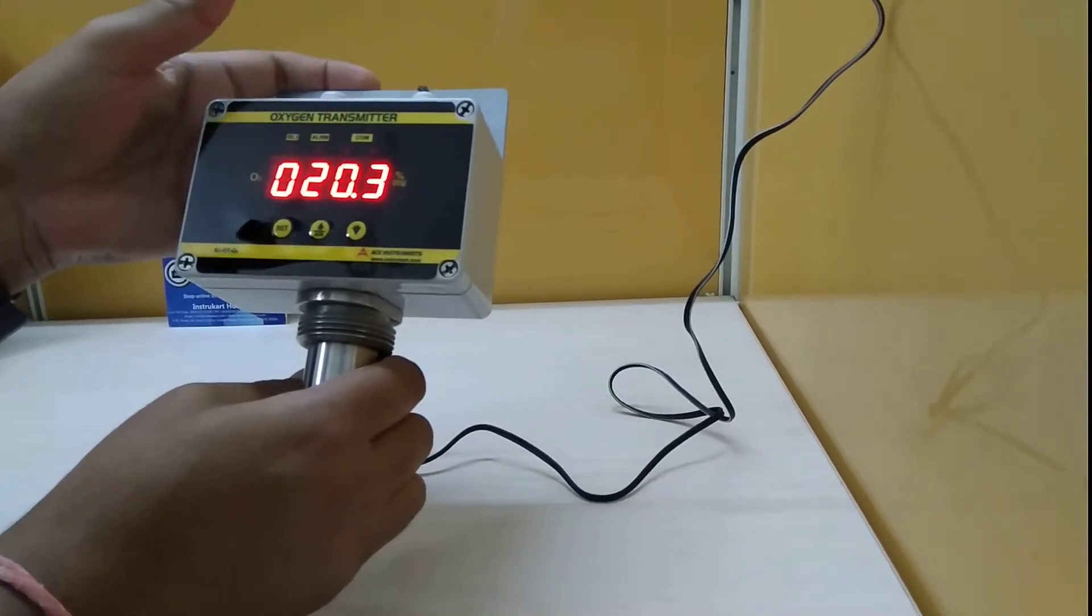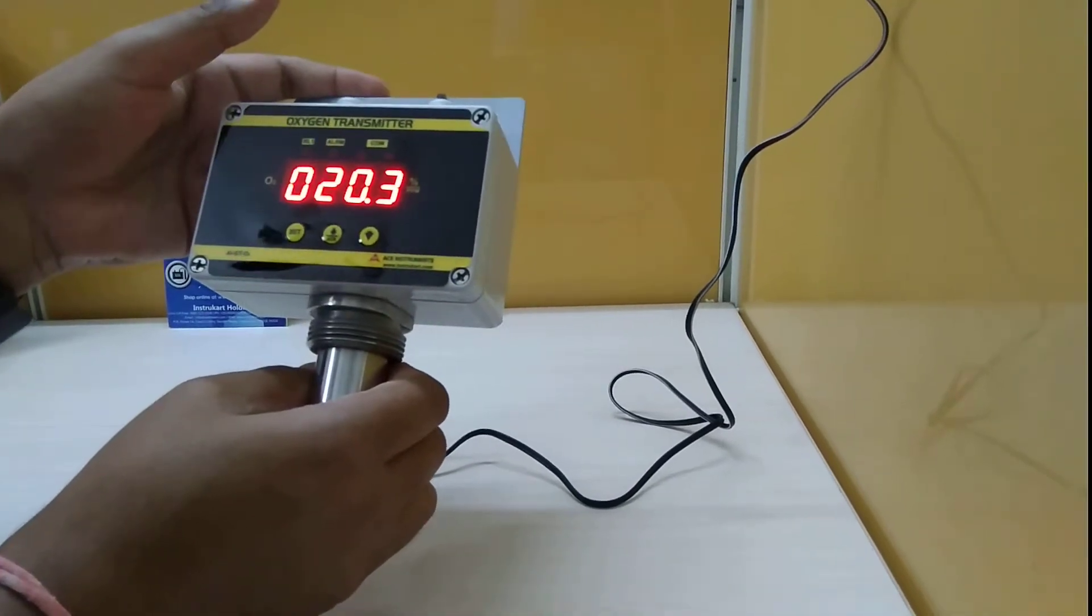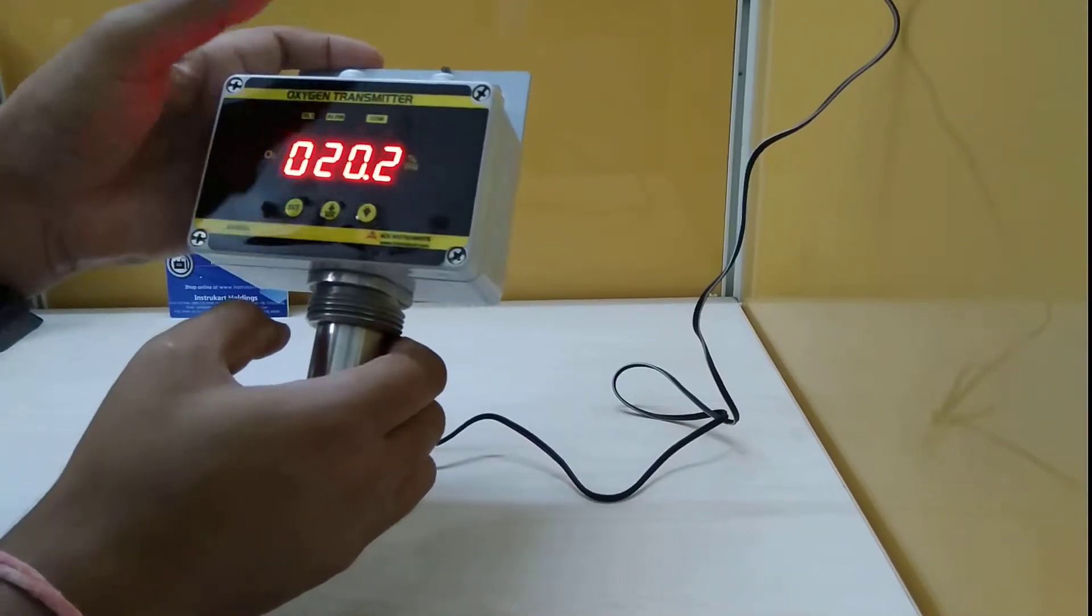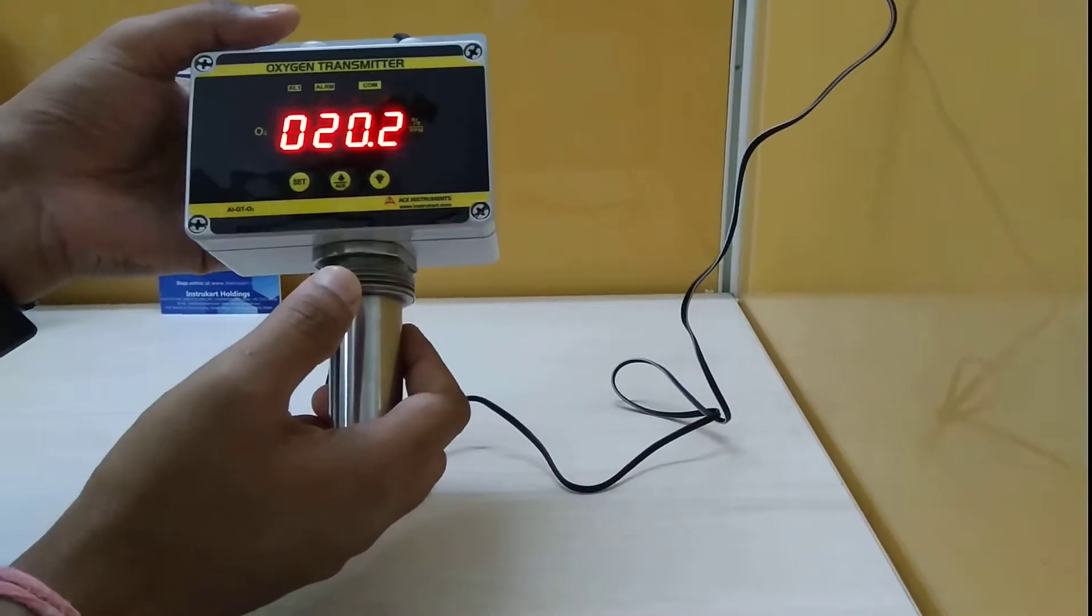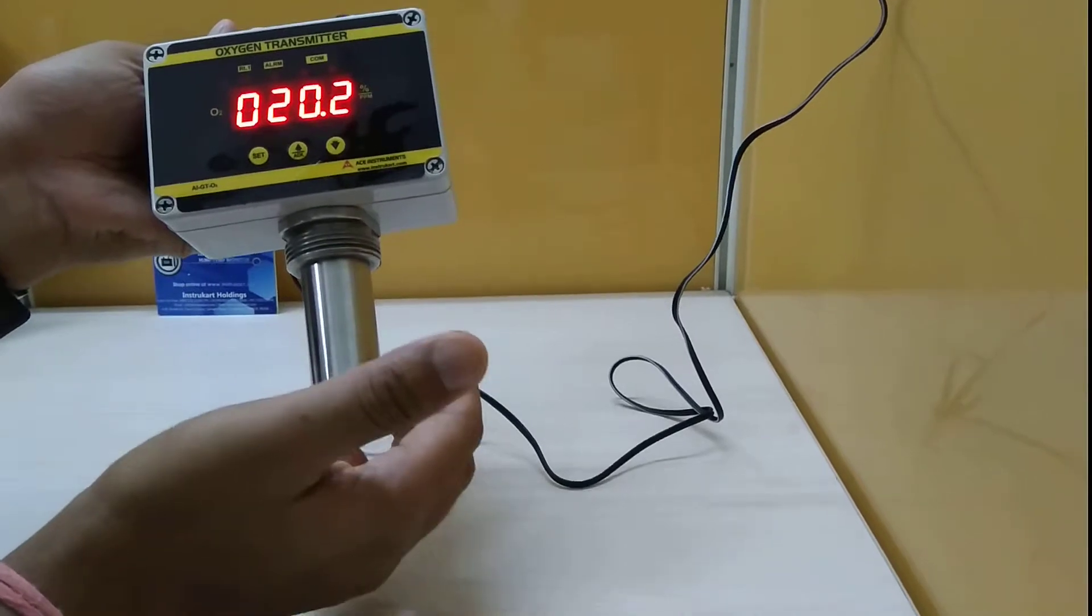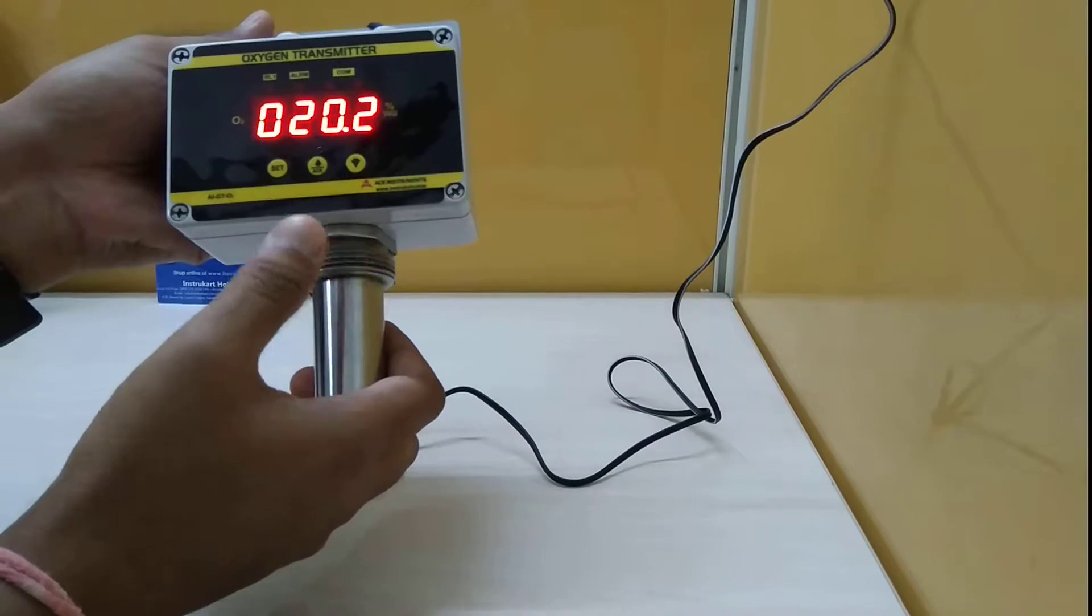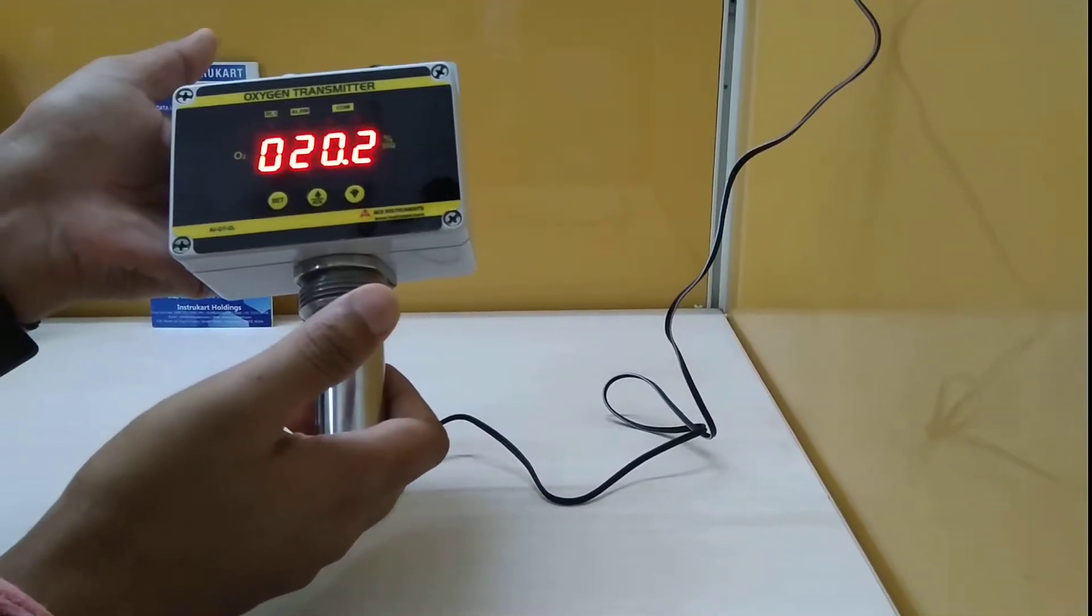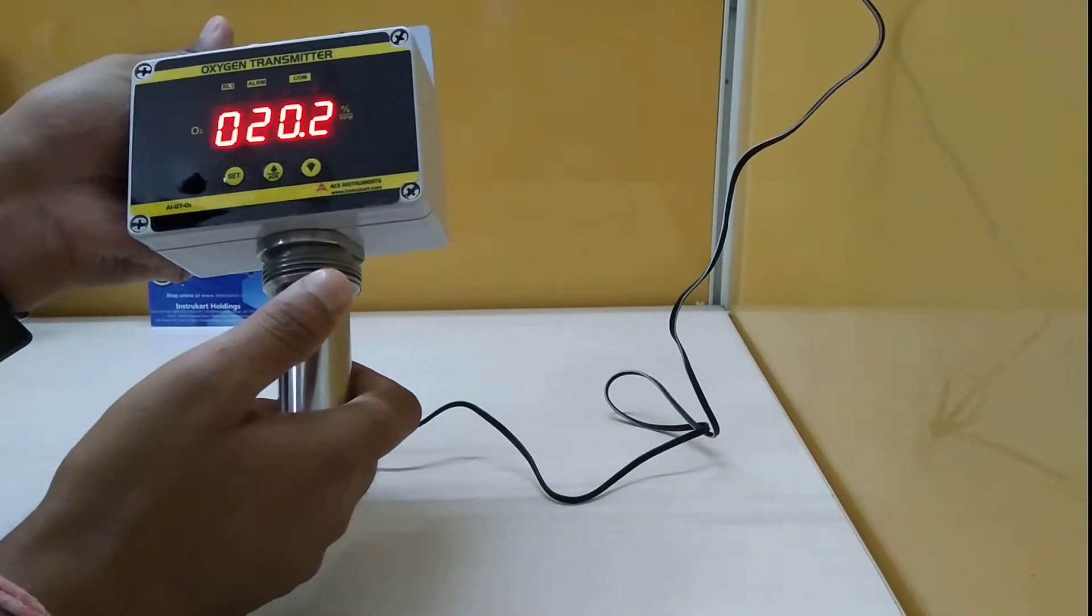It has a relay output which is normally open/normally closed, and features a three or four digit seven-segment LED display showing readings in percentage volume. Currently we can see it's reading 20.2%, and the ambient oxygen level is approximately 20.9%, which is correct for breathing at altitudes near mean sea level.